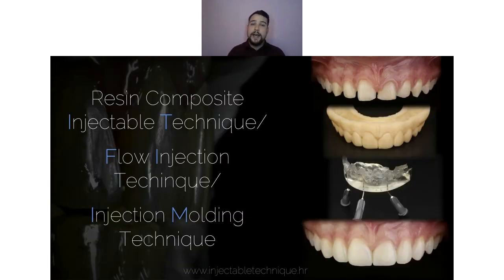So, a short introduction about this technique. The name is resin composite injectable technique or flow injection technique or injection molding technique. Those are all synonyms for the same thing, for the same technique, or better, let's say, for the same concept.